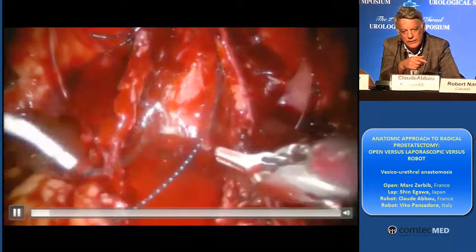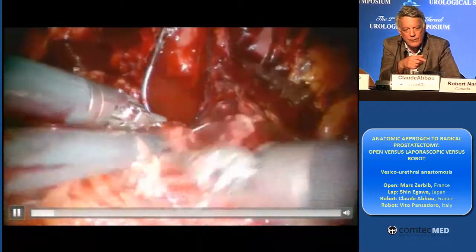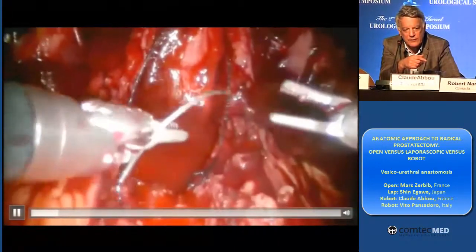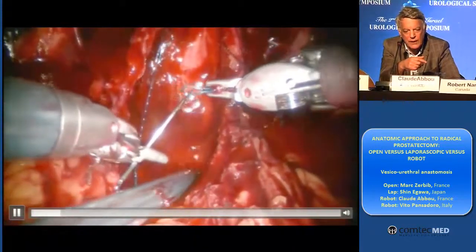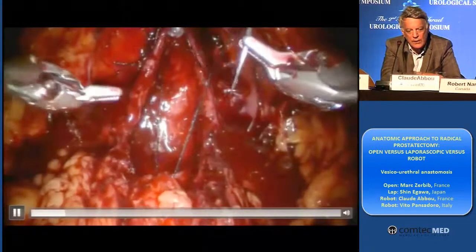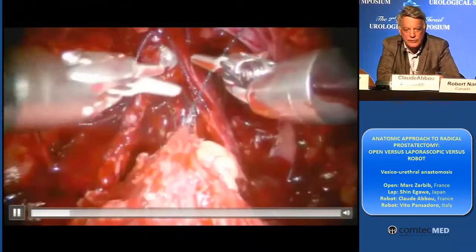You can see in this patient the two bundles. Very well done. And you can see the posterior layer taking the posterior aspect of the bladder neck and posterior aspect of the urethra. And we use the V-lock. I think the V-lock helps a lot — so, barbed suture.